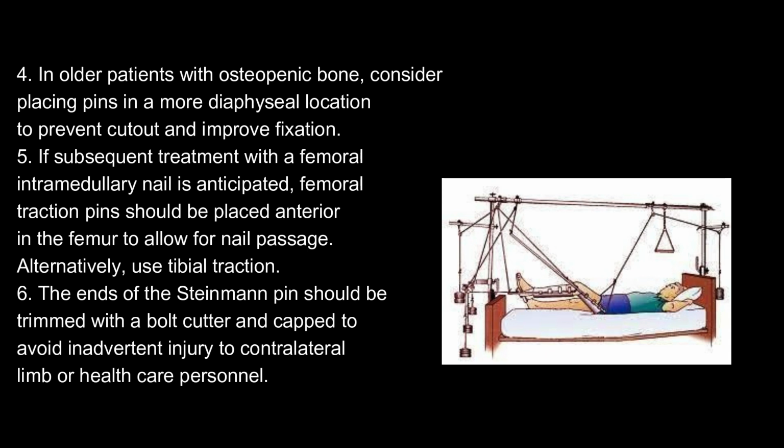4. In older patients with osteopenic bone, consider placing pins in a more diaphyseal location to prevent cutout and improve fixation. 5. If subsequent treatment with a femoral intramedullary nail is anticipated, femoral traction pins should be placed anterior in the femur to allow for nail passage. Alternatively, use tibial traction. 6. The ends of the Steinmann pin should be trimmed with a bolt cutter and capped to avoid inadvertent injury to contralateral limb or healthcare personnel.